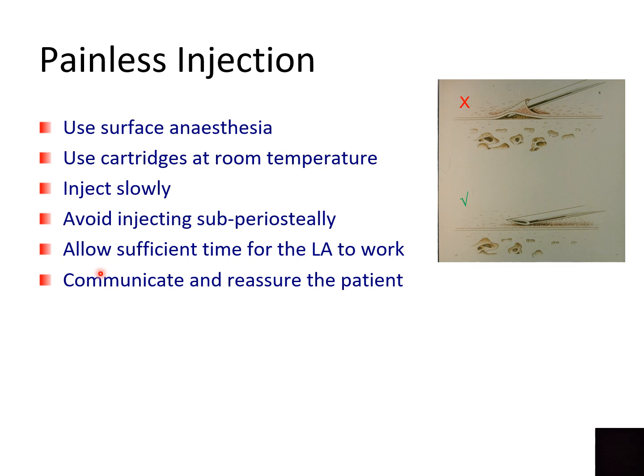Now then, again, as discussed in the previous slide, allow sufficient time for the LA to work, and at least 3 minutes is the bare minimum that you would allow from the time of completion of the injection and start of your operative treatment. And finally, communicate and reassure the patient throughout their treatment session.